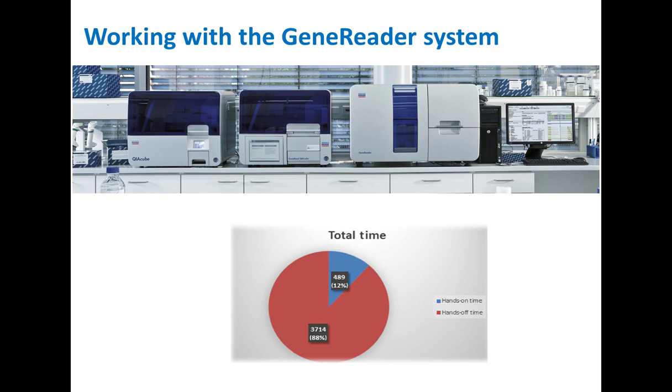In our in-house pipeline, protocols and reagents used in the different steps of the pipeline have to be synchronized. Globally, there is a very low hands-on time, less than 10 hours, but a hands-off time of nearly 60 hours.